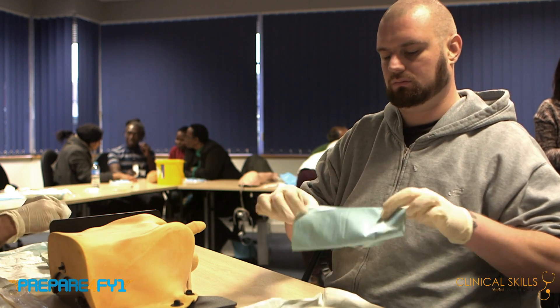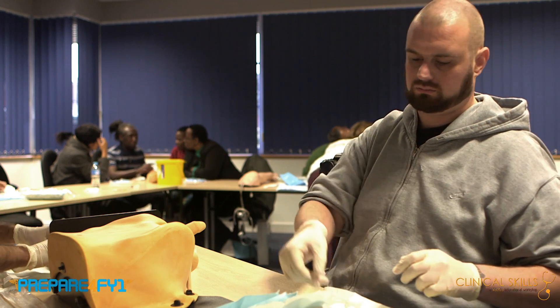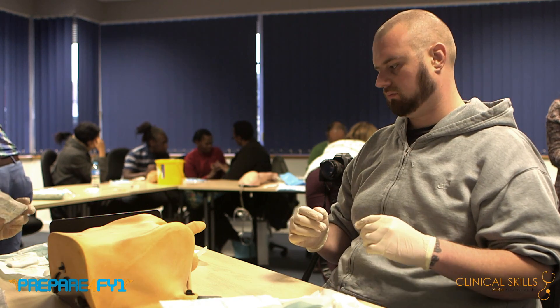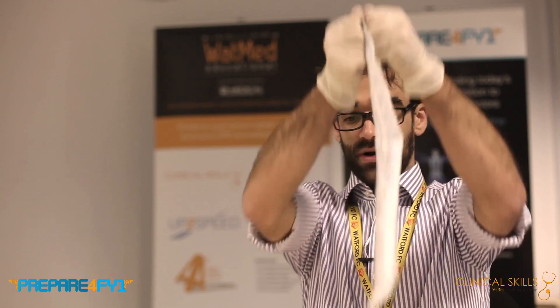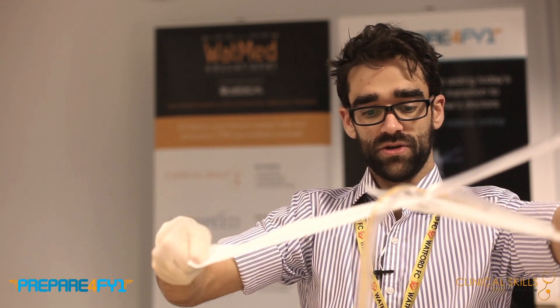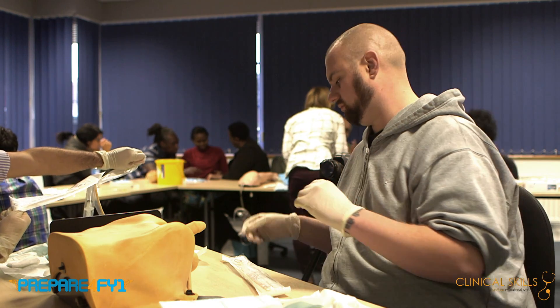You need the cotton wool swabs in the galley pot — pop those there — and then the three swabs as well, ready. When you open the catheters, you have equidistant pressure with your thumbs either side of opening it. You want to hold it up above your sterile field so it doesn't de-sterilise it, and then you drop it onto your field.